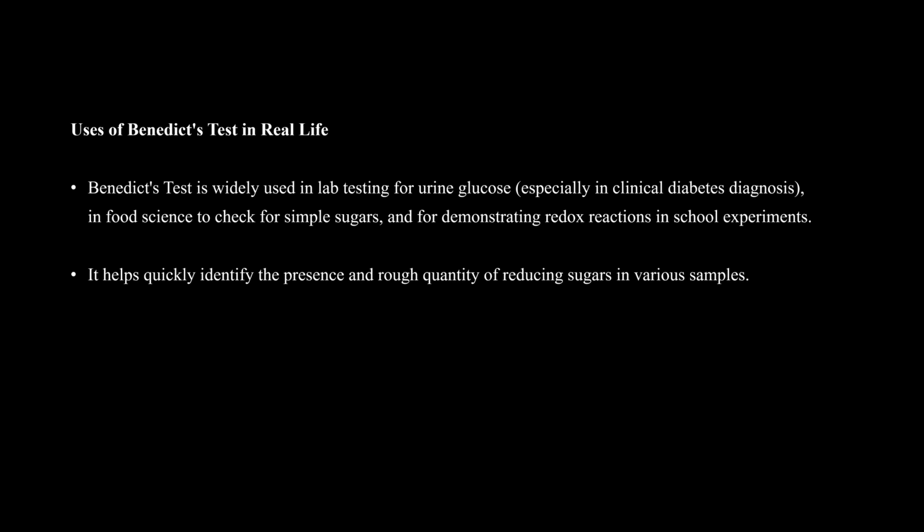It provides a quick way to identify the presence and the approximate quantity of reducing sugar based on color change from blue to green, yellow, and brick red.